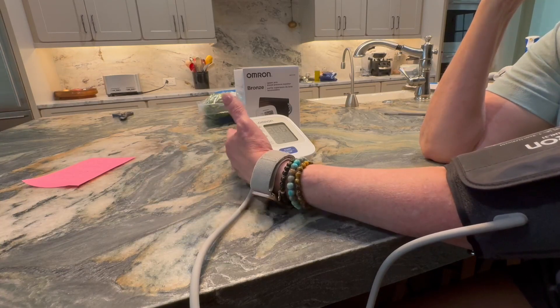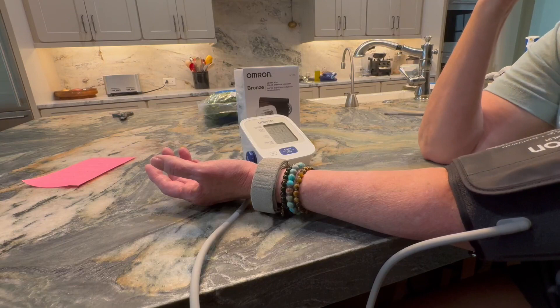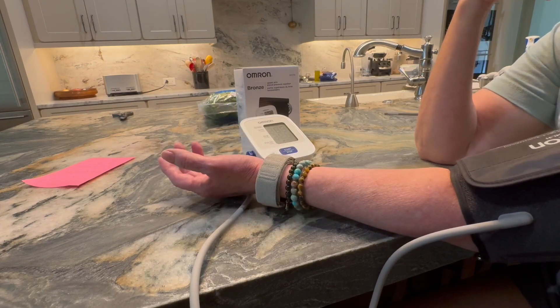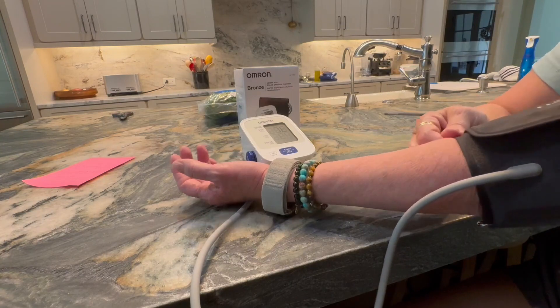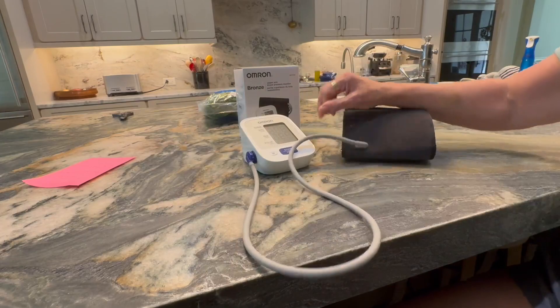This one was recommended to me by a medical professional, so I like it a lot. I've used it for about three weeks now and I will absolutely continue using it. Give it a try — I know you'll like it too.